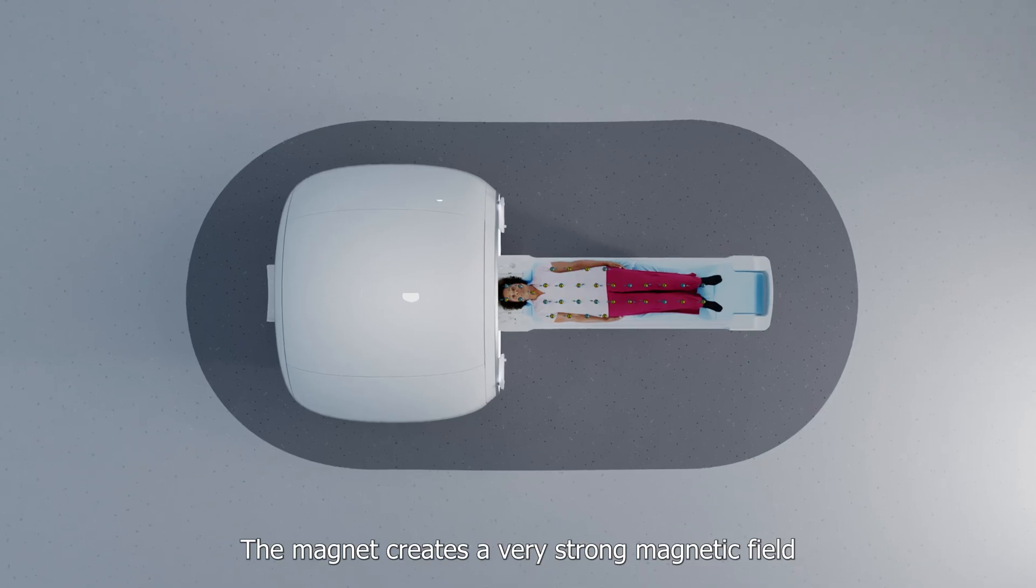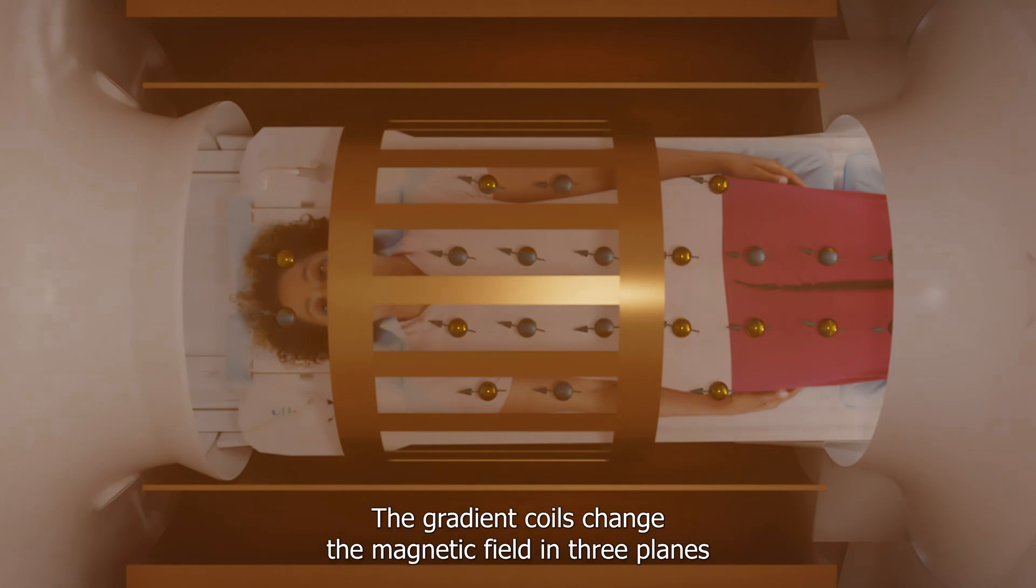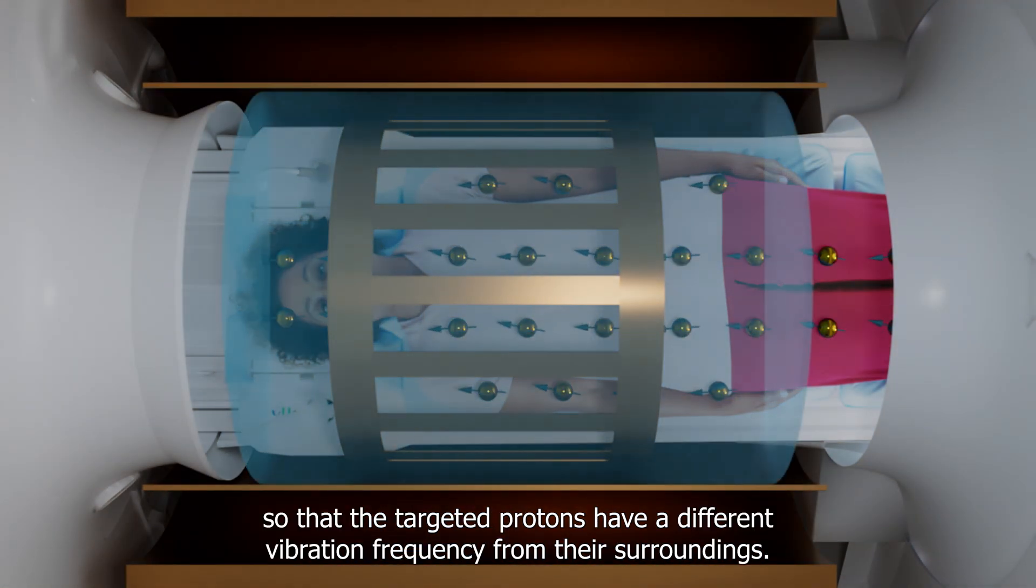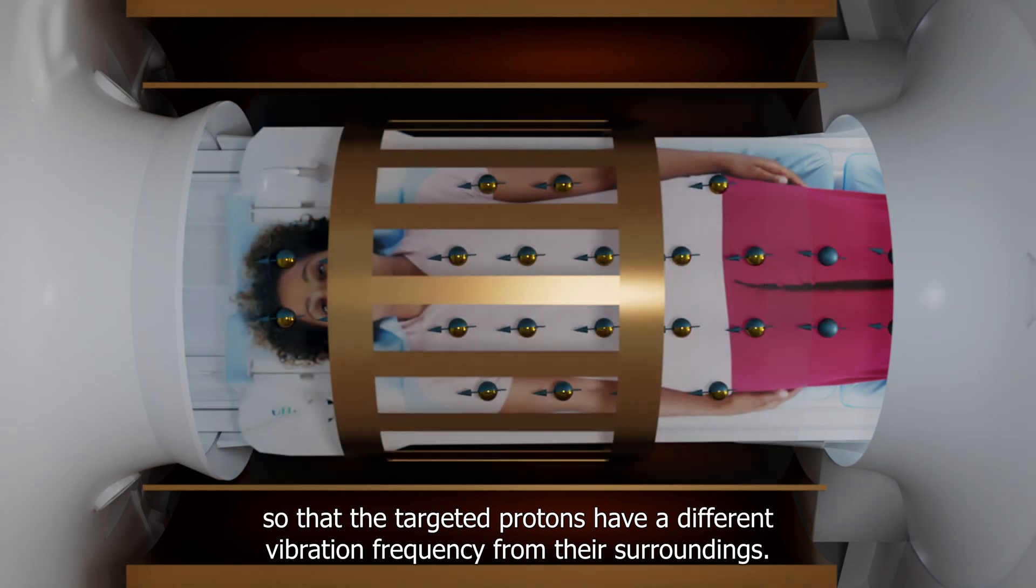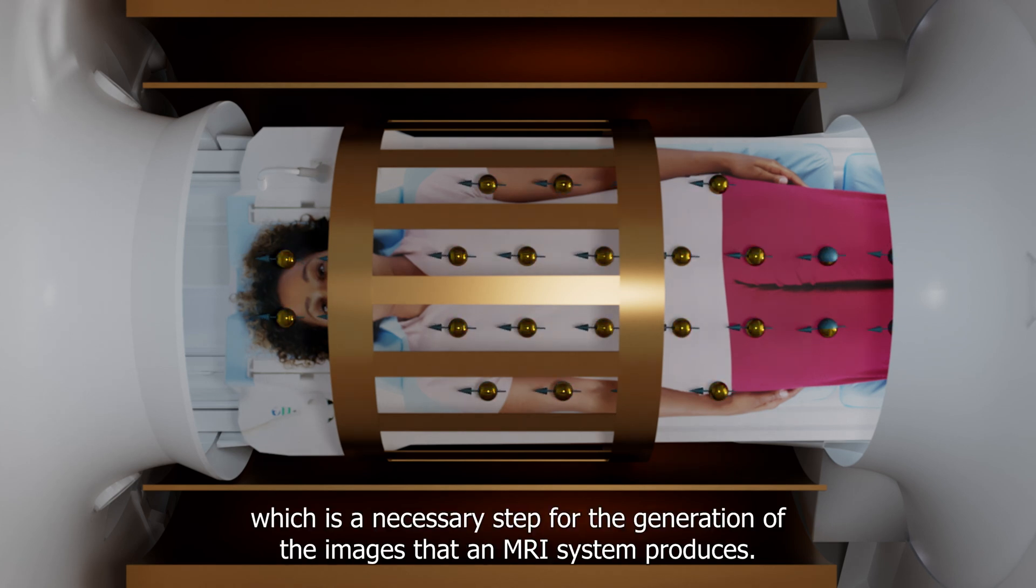The magnet creates a very strong magnetic field that aligns the protons in the body. The gradient coils change the magnetic field in three planes so that the targeted protons have a different vibration frequency from their surroundings. This allows localization of the protons, which is a necessary step for generating the images that an MRI system produces.